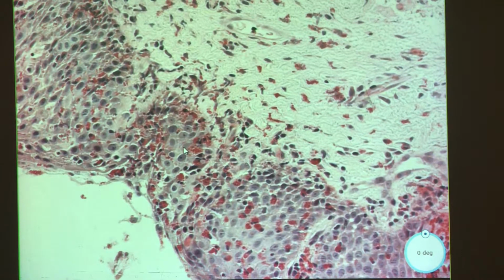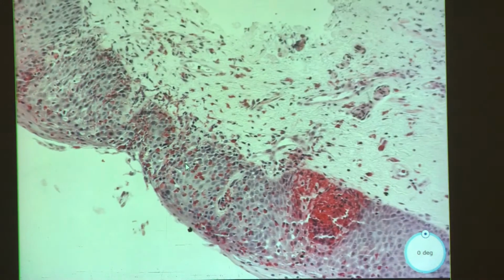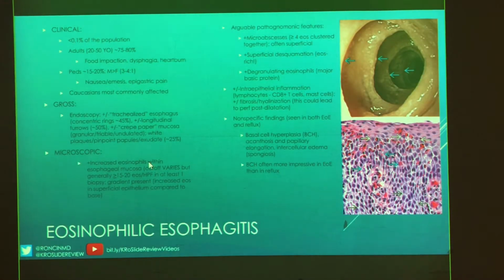Alright. So do we need to say anything else about this? This is eosinophilic esophagitis. Well, we have to give it an eosinophil count, don't we? That is correct. And the sources do vary a little bit. But generally you want to give a count, and then if this was a recurrent biopsy, you'd want to compare to the previous, so that the clinicians can see whether the treatment we're doing or the change in diet is working, even more so with peds, because kids can't always voice what's going on. So that's a good parameter to look at. Excellent. So you nailed it.